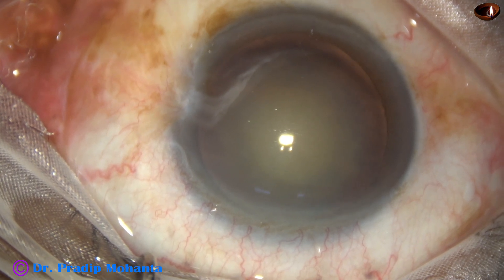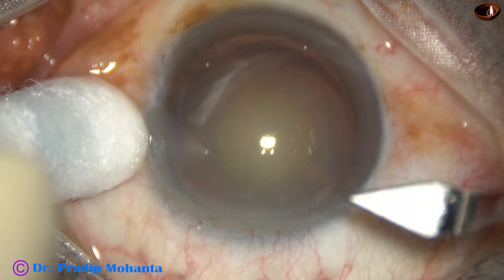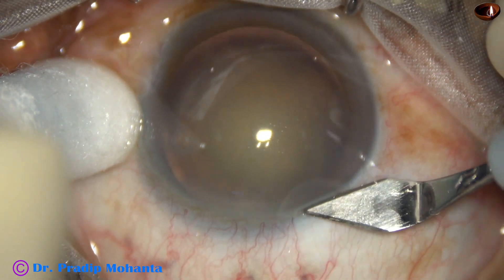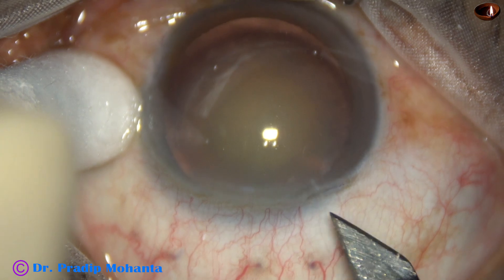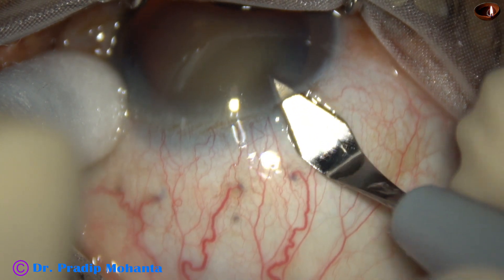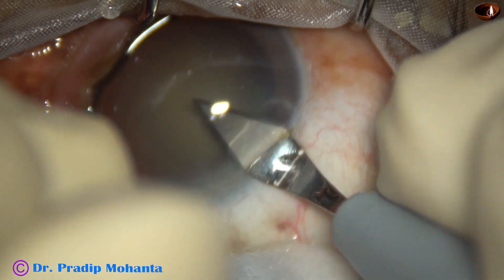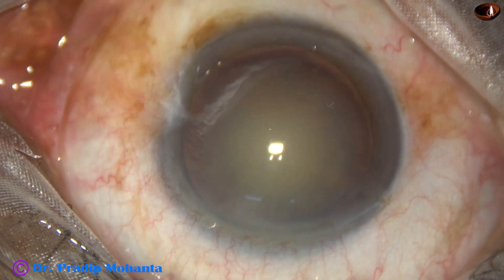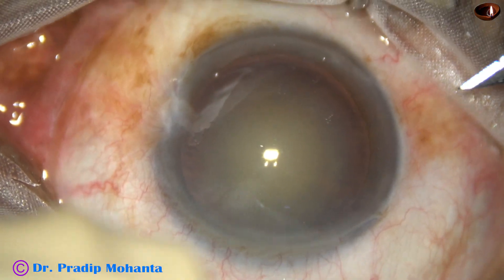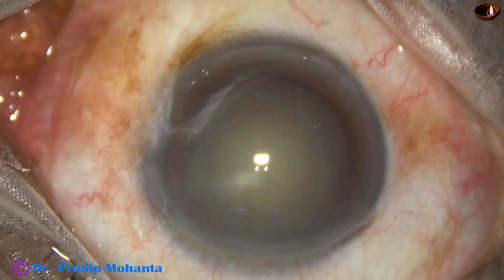And now, the main incision. This is a steel keratome, 2.8 mm. The main incision is at mid-limbus. I always include some capillaries and let it bleed a bit. Healing becomes better if we include some capillaries in the incision.